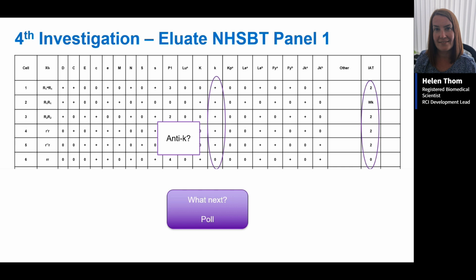So what did I do next? Did I confirm or exclude the presence of anti-little K? Did I confirm or exclude the presence of other antibodies? Did I do nothing because I'm good to go, all sorted? Never mind that you were really smug that you thought it was just going to be a pan-reactive eluate. Or did I cry? It could have been any of those answers. You can pick more than one if you want.